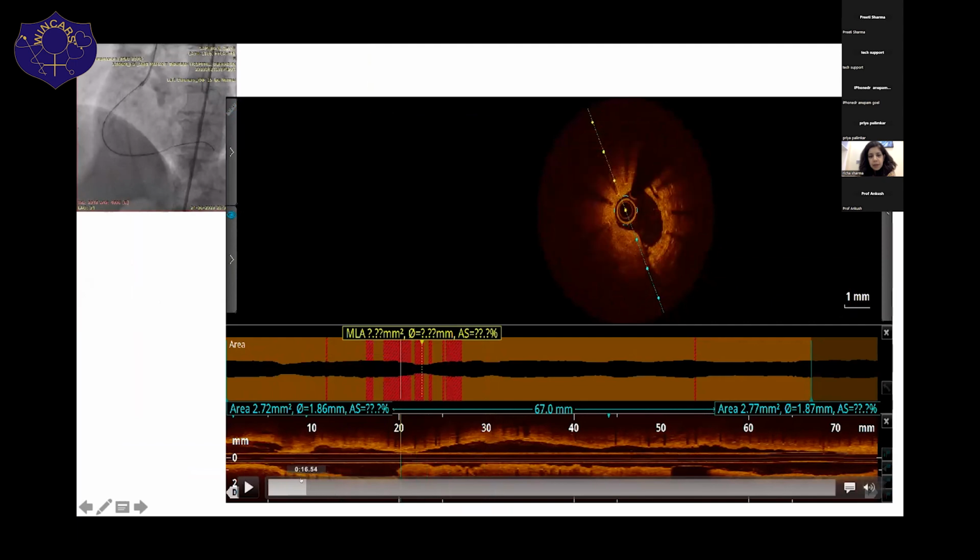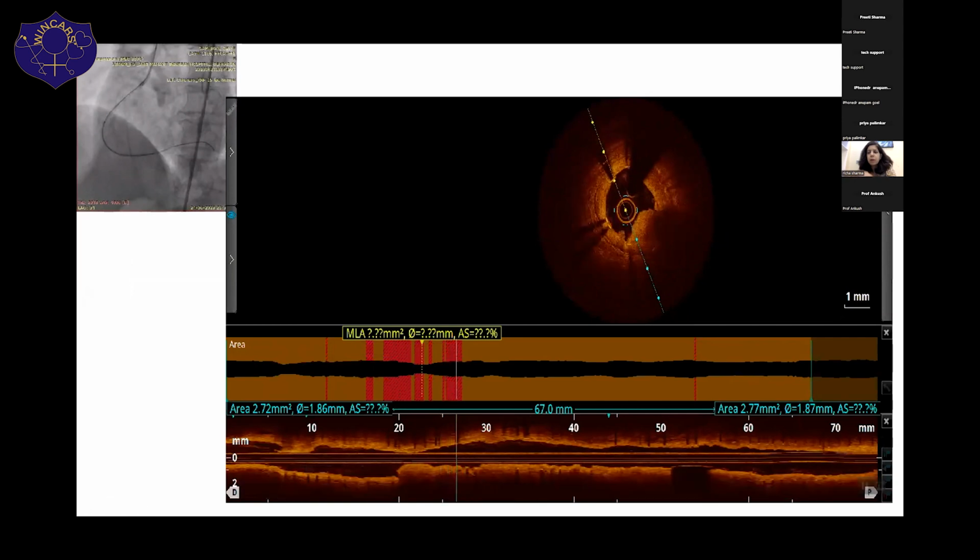this was the area where I had a calcium nodule, because of which nothing was getting inside the lumen except for the wire. There was so much difficulty. This calcium nodule showed it beautifully. This particular calcium nodule extended almost up to 4 to 5 millimeters. And thereafter, we had both neointimal hyperplasia as well as neoatherosclerosis in this patient.